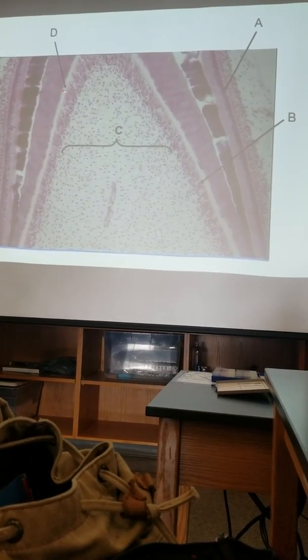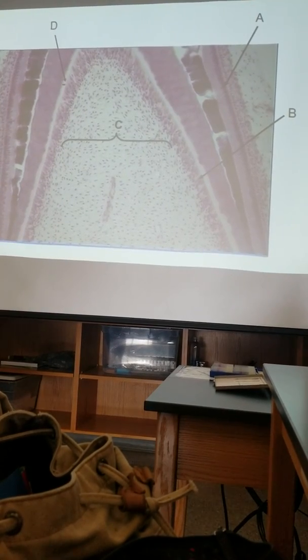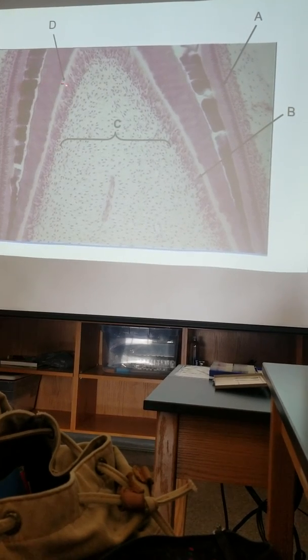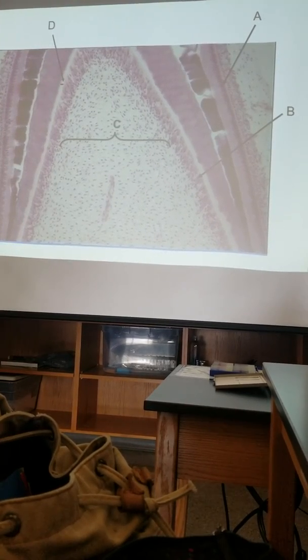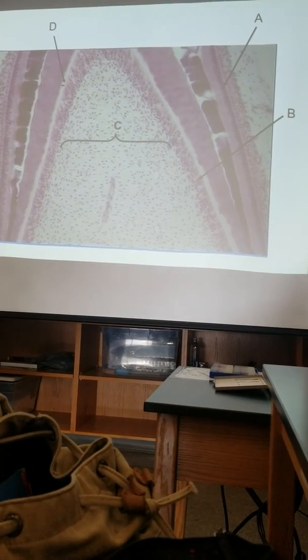And then what is D? Predentin. Yeah, a little tricky specific there. This is the dentin, this is the predentin. So I was actually looking for predentin. Had to say pre. Okay, guys.